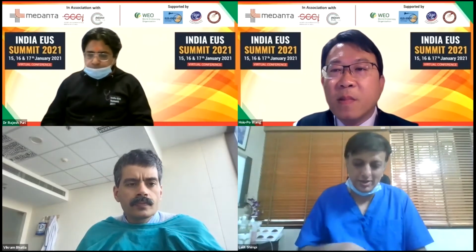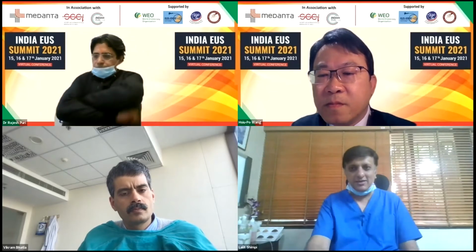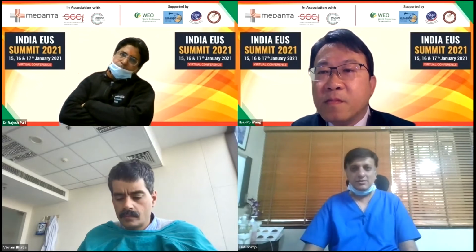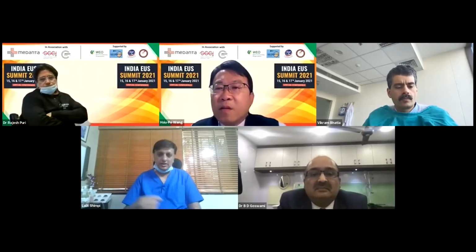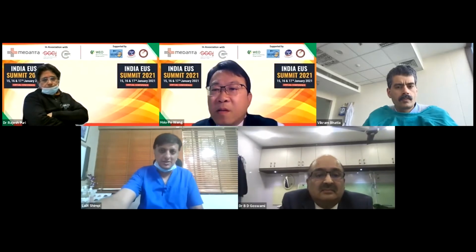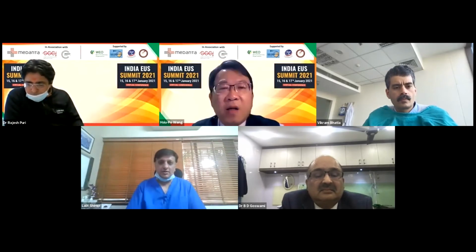Lalit Shimpi. So this Moray forceps seems to be a very interesting kind of accessory. Is it available commercially? Do you think that in future we might be using this through the 19 gauge needle as a substitute for taking biopsies or EUS FNB if it is increasing yield? Any studies on using it in usual kinds of biopsies, EUS FNA biopsy, rather than just in cystic tumors? Do you mean the micro forceps? Yes, the Moray forceps.